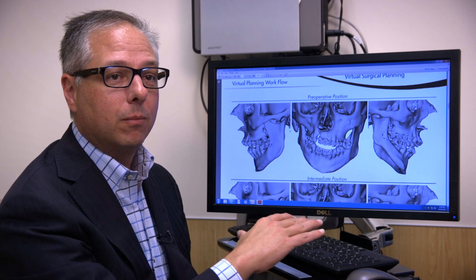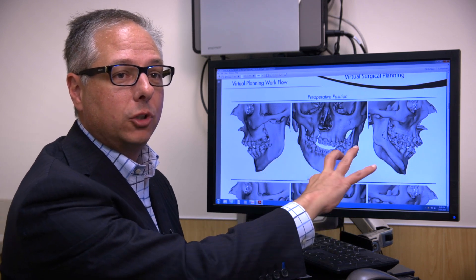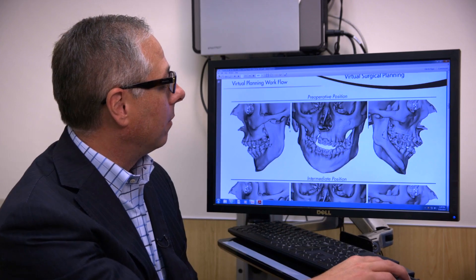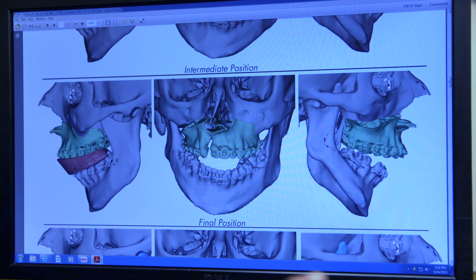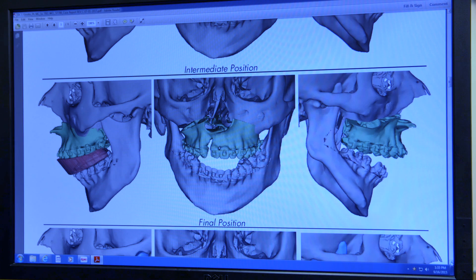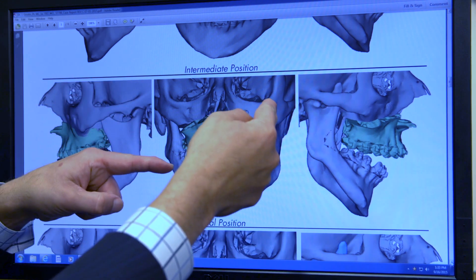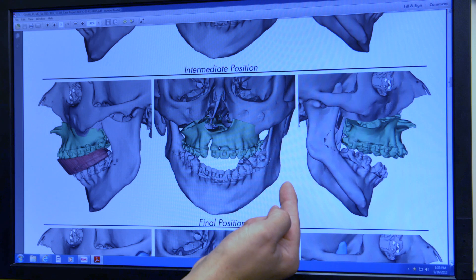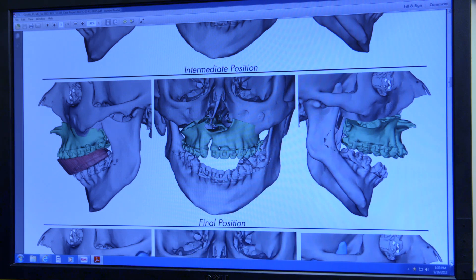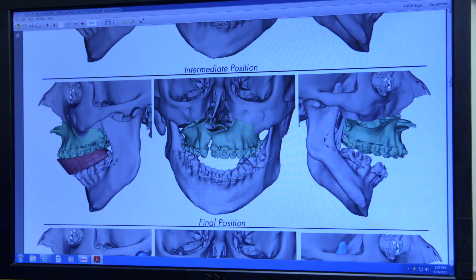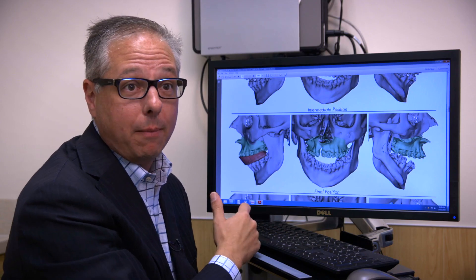The first step on the computer is to move the upper jaw as we would do in surgery. Using the computer, we can make those cuts and reposition the upper jaw in the new orientation that we want. For this patient, the left side came up as the right side came down, with a space for an interpositional bone graft. Once the first part of the procedure is completed on the computer, we're then able to fabricate a splint to guide those procedures in the operating room.